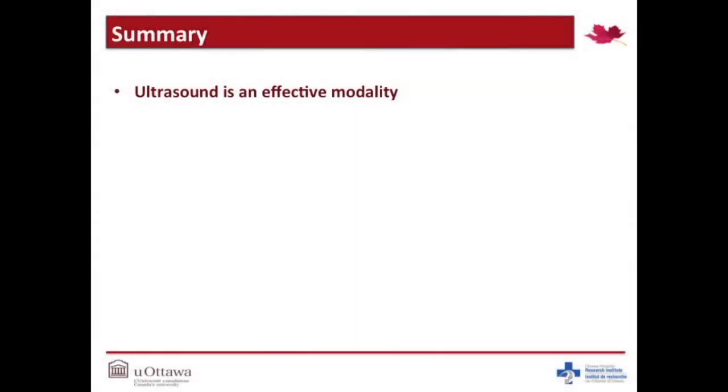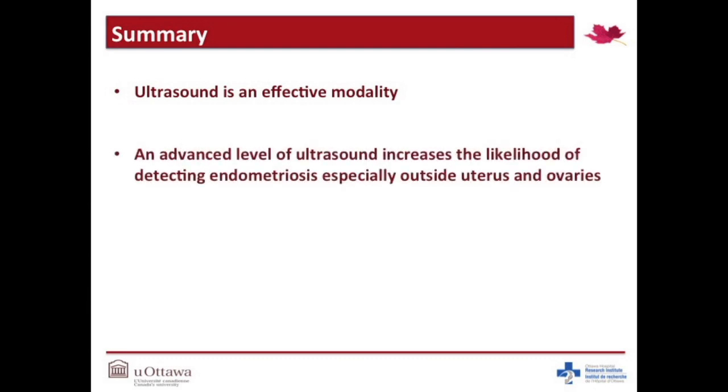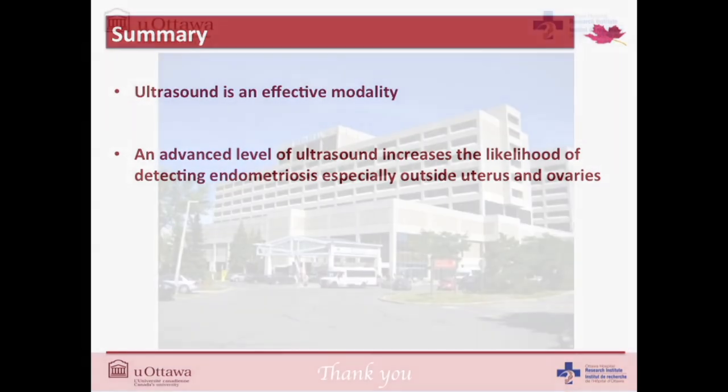In summary, ultrasound is a simple and an effective modality to diagnose endometriosis, and an advanced level of ultrasound increases the likelihood of detecting endometriosis, especially the deep form involving organs other than ovaries and uterus.